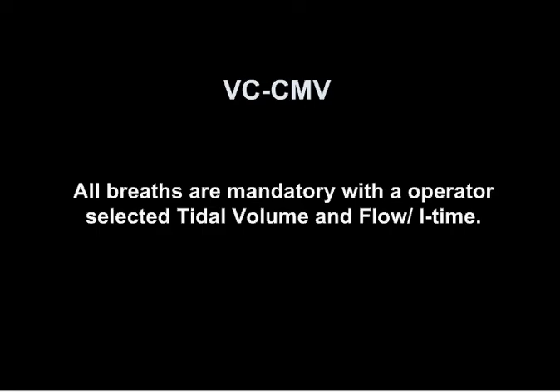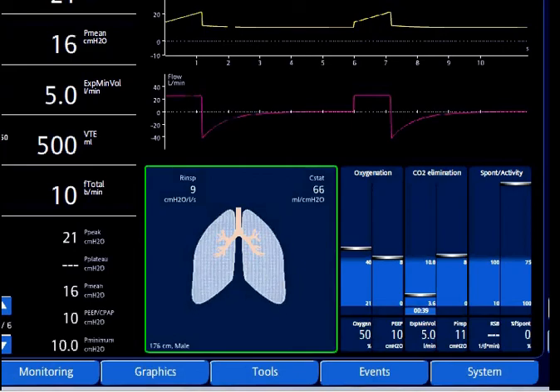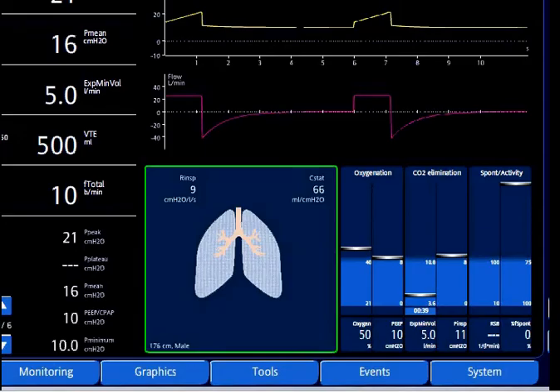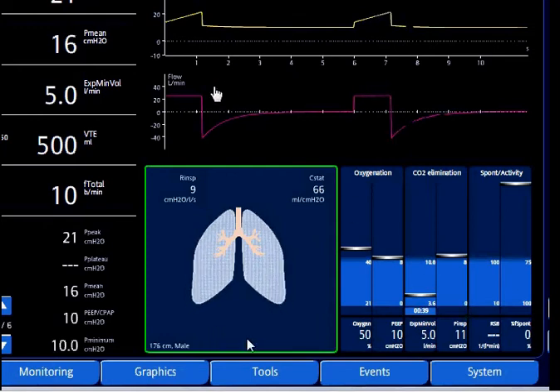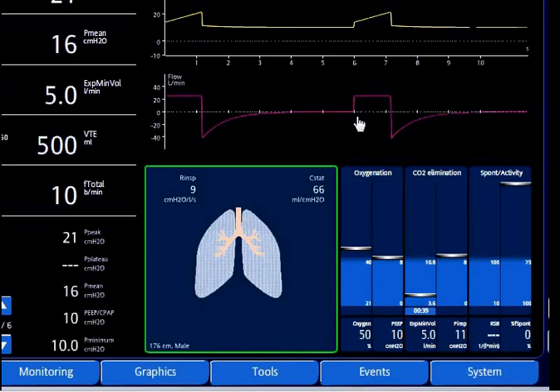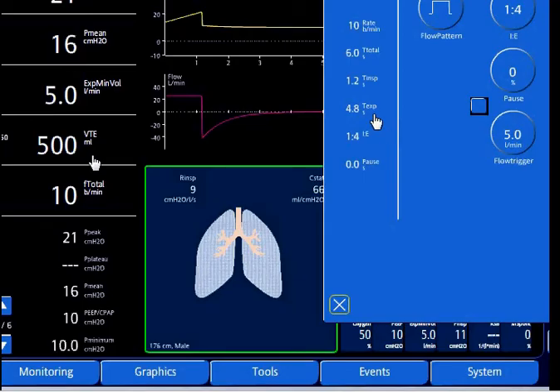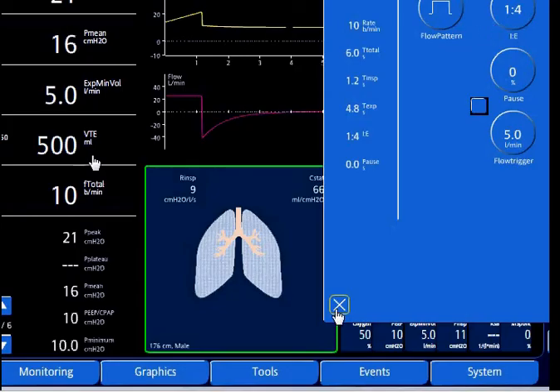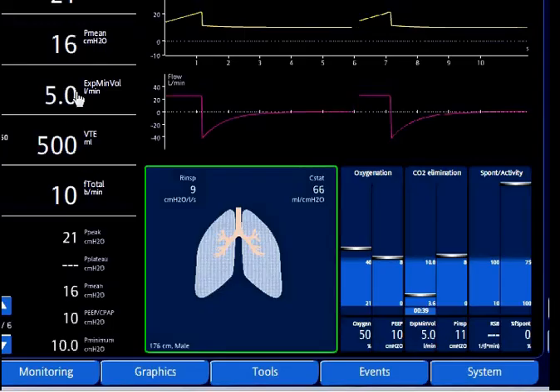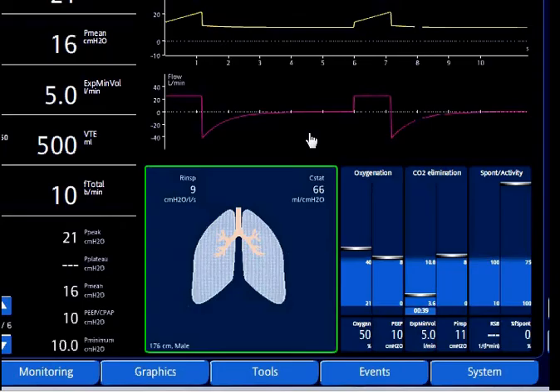First, VC-CMV. All breaths are mandatory with the operator-selected tidal volume and flow rate or inspiratory time, depending on the ventilator. Here is an example on my simulator with a set breath rate of 10. We notice a fixed inspiratory flow rate for a fixed amount of time — a 1.2-second I-time based on an IE ratio, flow, or I-time setting. If a patient spontaneously breathes, the spontaneous attempts will be followed by mandatory breaths for that fixed volume or flow for the fixed amount of time.